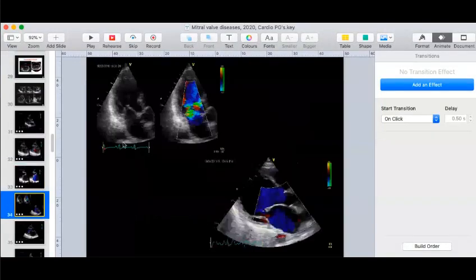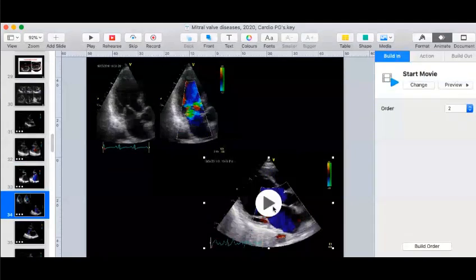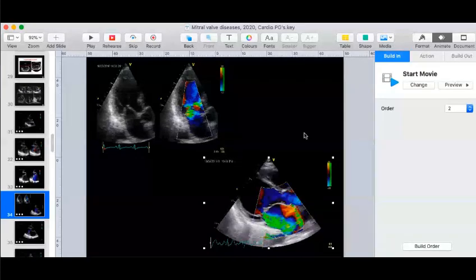Now, what is the problem here? There is MR. And what direction is the jet? Posterior direction. Fine. So what do you think? Which leaflet is involved? Here it is PML. Okay. So this is a different pathology here. What is different here? Ischemia. Yes, posterior. Exactly.